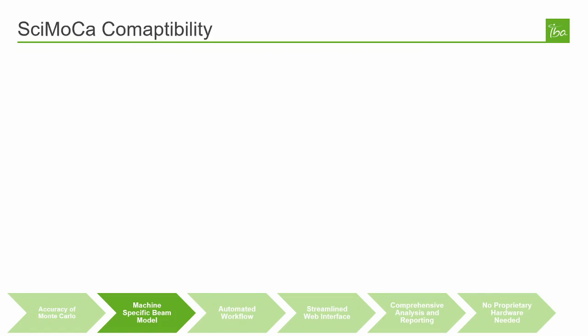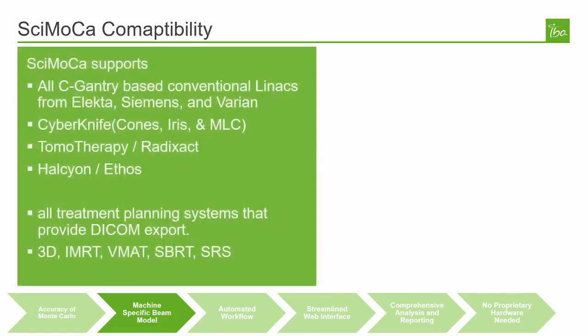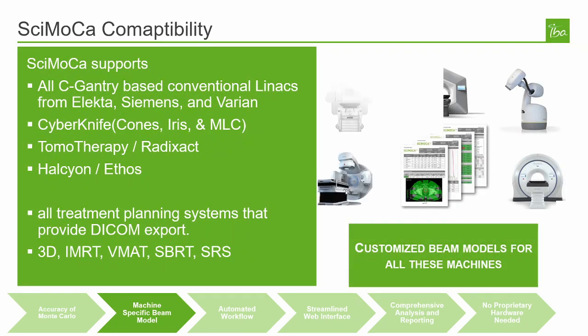From the perspective of device compatibility, SciMoCa supports a wide variety of machines. Specifically, SciMoCa supports all C-gantry Linacs from Elekta, Siemens, and Varian. Also supported are CyberKnife machines, Tomotherapy, and the Halcyon and Ethos machines. And SciMoCa will work with all treatment planning systems which provide a DICOM export.